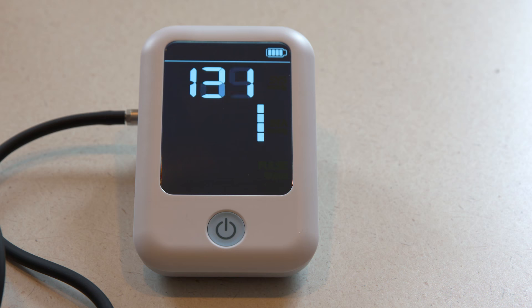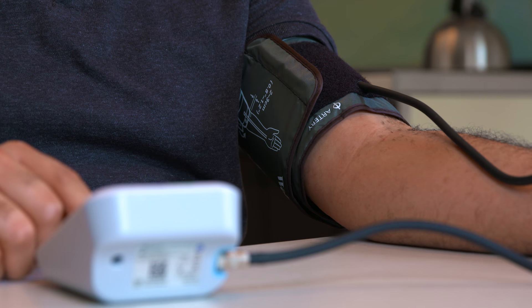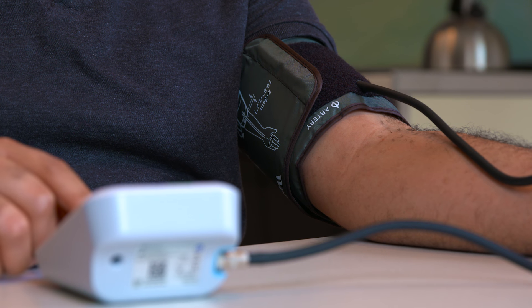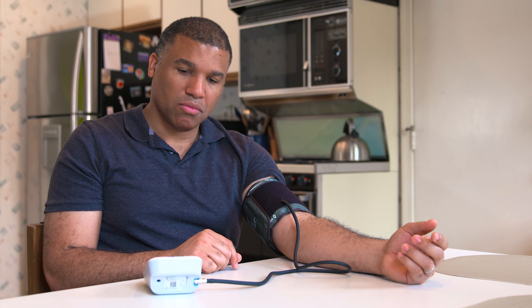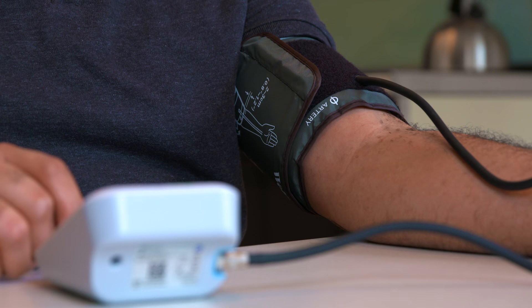Rest for five minutes before taking your blood pressure. When you're ready, turn on the machine and press start. The cuff will inflate and slowly deflate by itself. Do not talk, read, text, or watch TV while measuring your blood pressure. Stay still and relax.